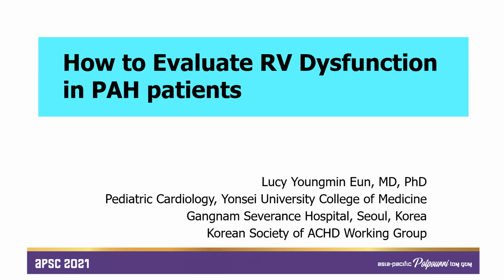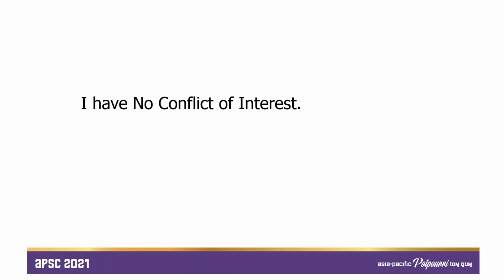My talk is how to evaluate RV dysfunction in pulmonary arterial hypertension patients. I'd like to mostly focus on echo. I have no disclosures.